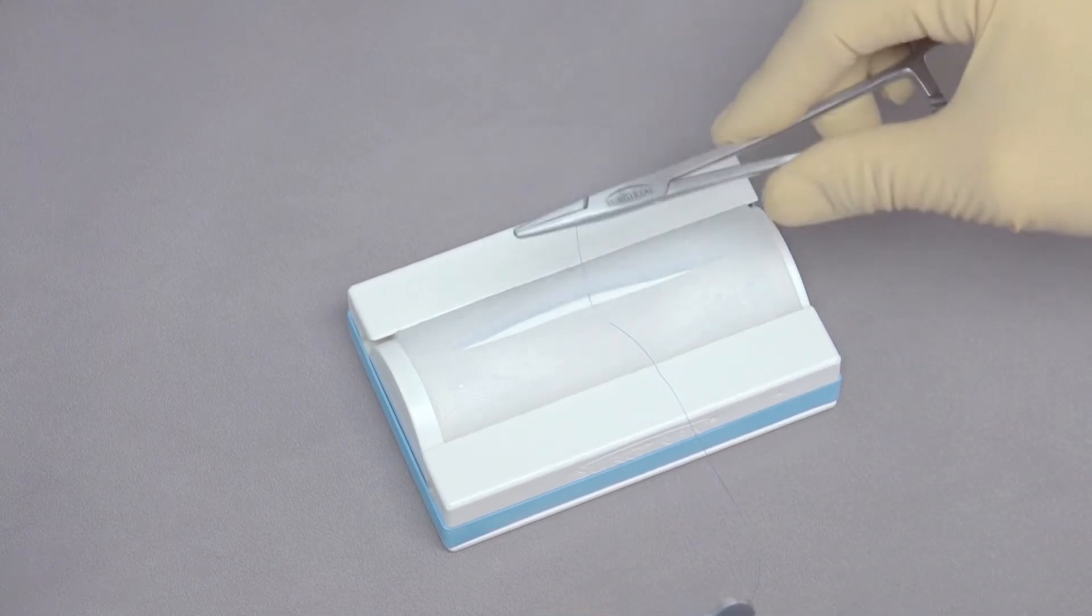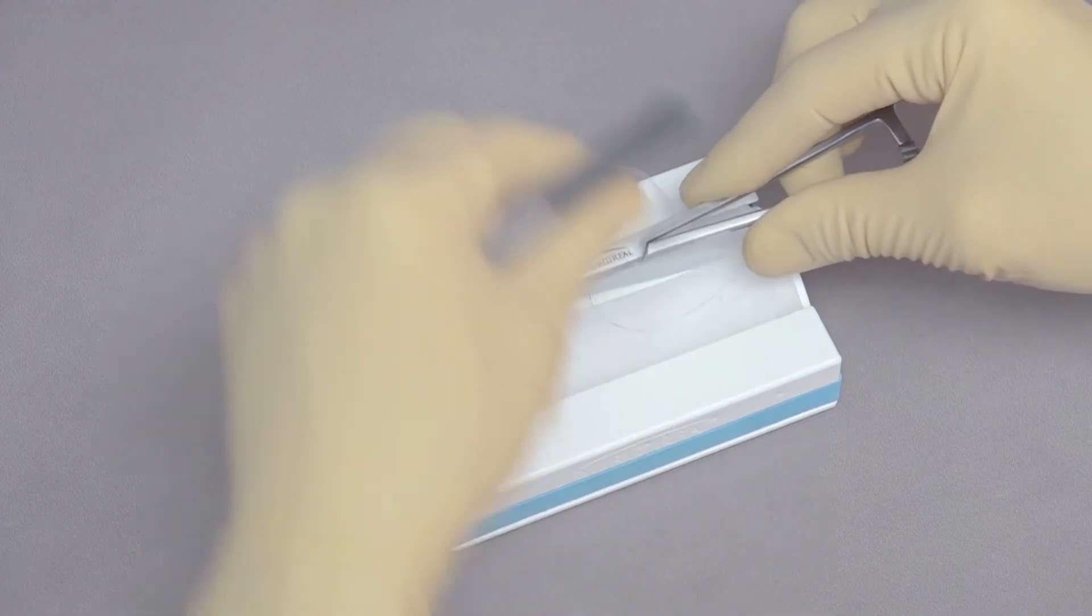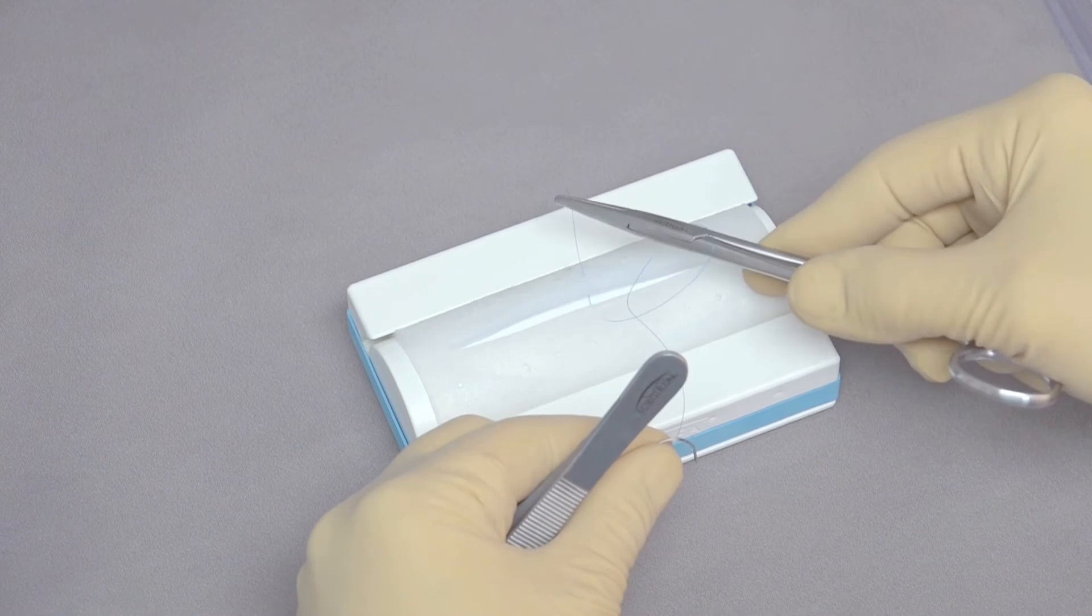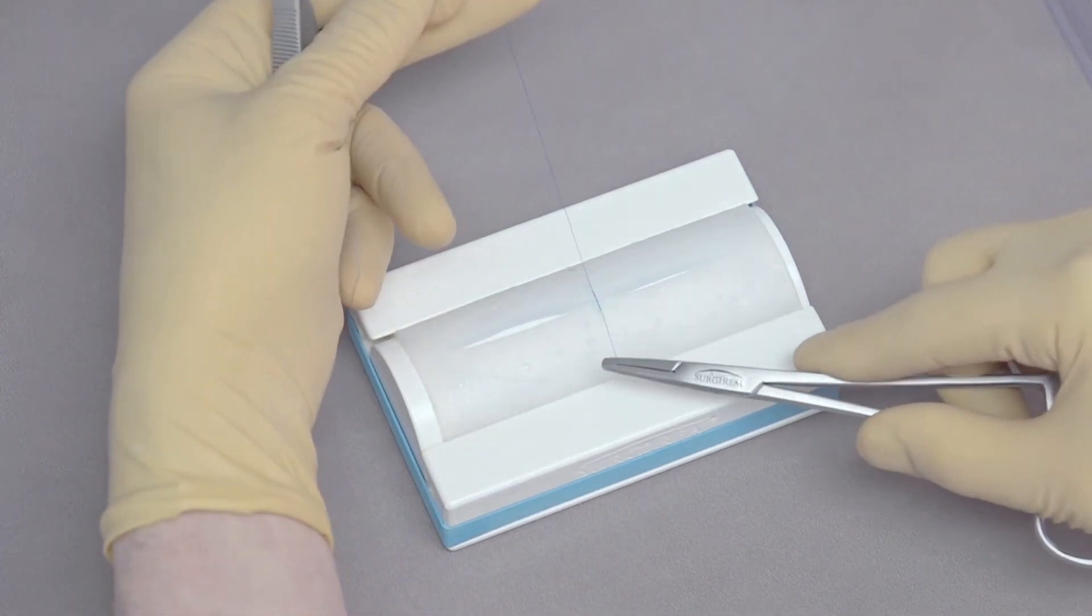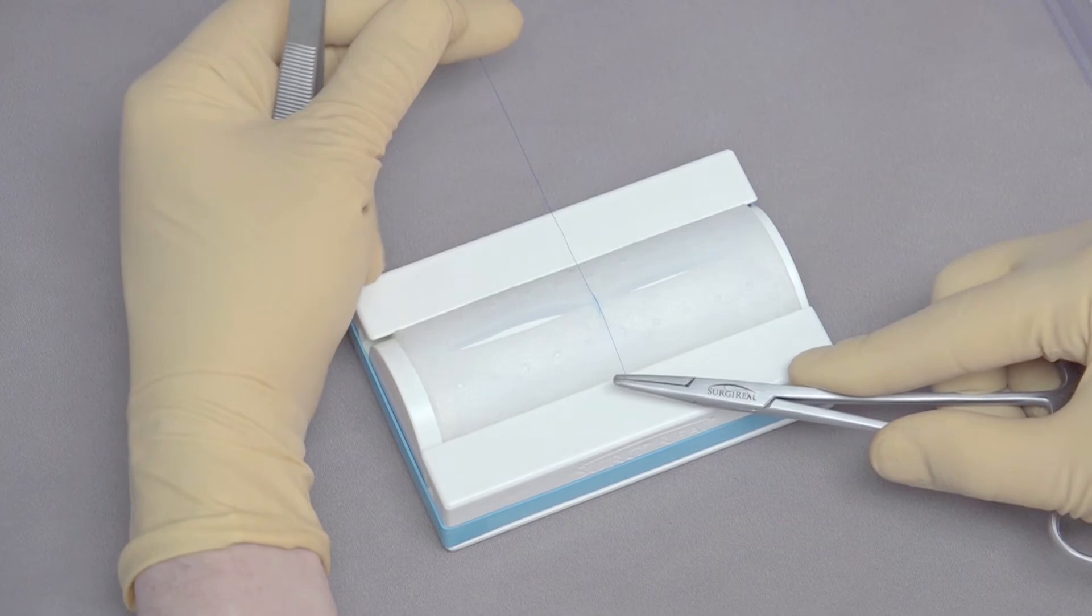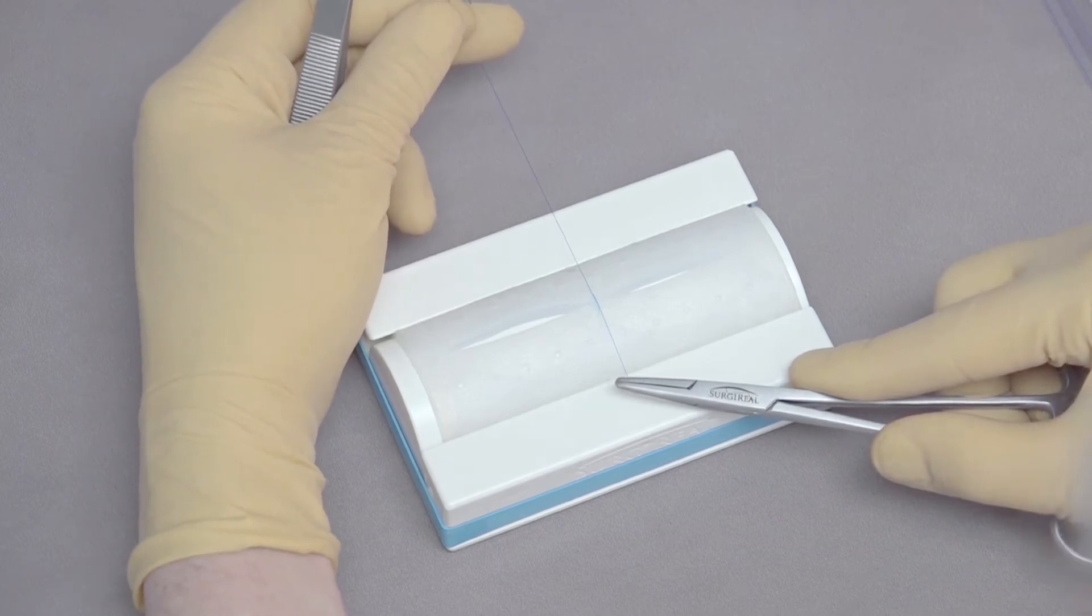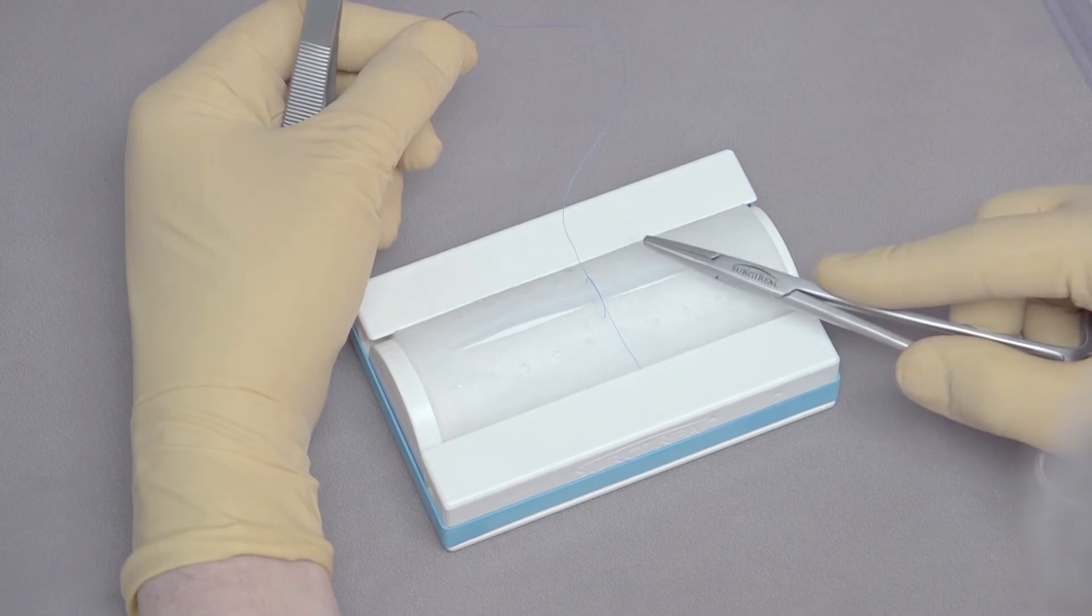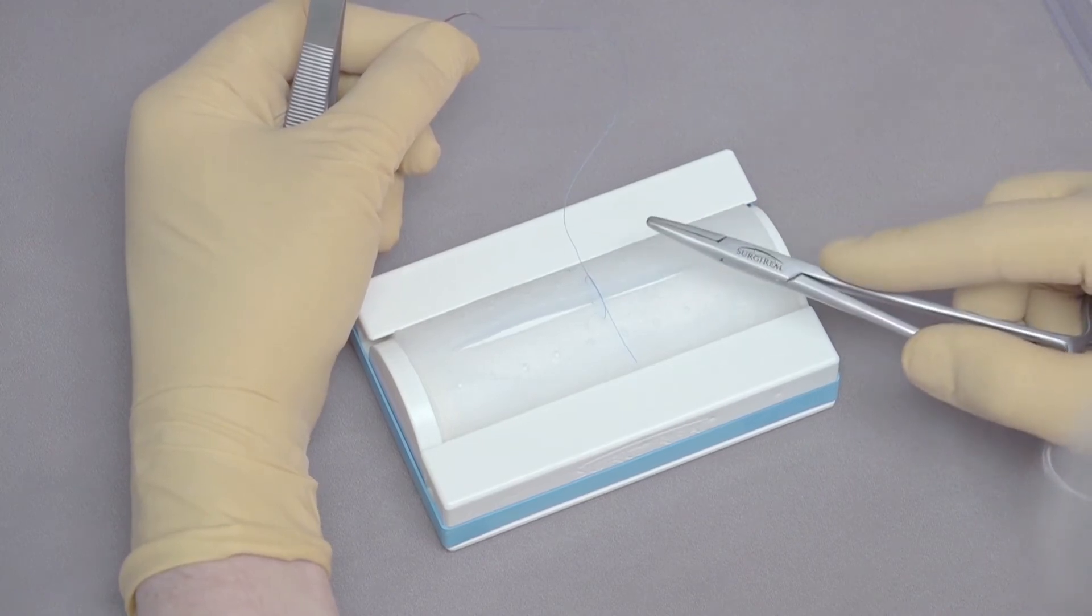To accomplish that, we're going to put the needle holders right in the middle of the incision and go around the needle holders one time. Grab the opposite side of the suture, we're going to pull the needle holders towards us and the long end of the suture away. Because this is a monofilament suture, when we let go it will start to loosen up. That's okay because the next throw will tighten it down.